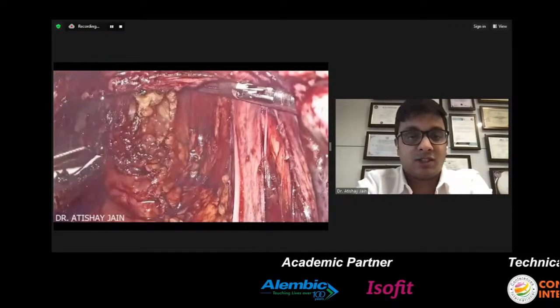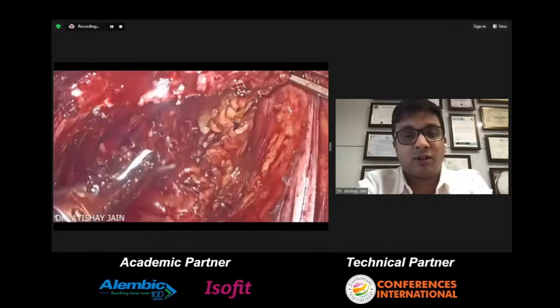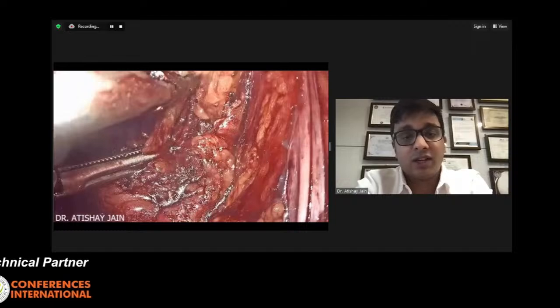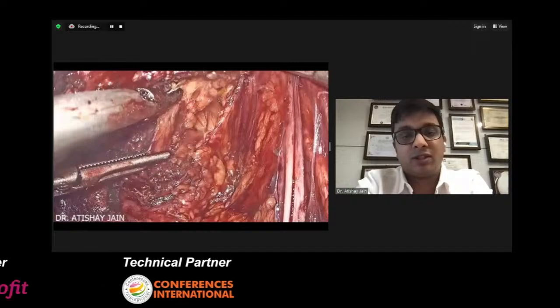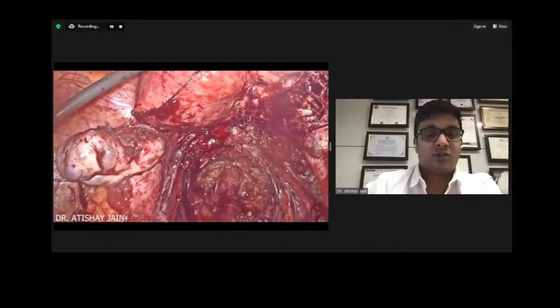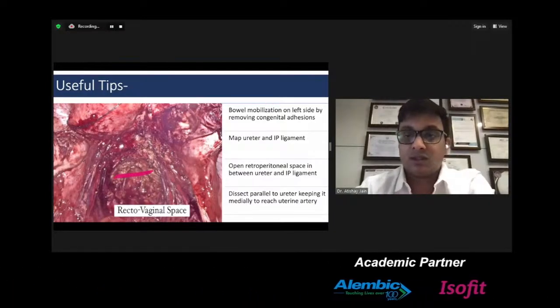So as you can see now, the rectovaginal space is being created, which is usually obliterated due to the involvement of the rectovaginal nodule. And the rectovaginal nodule you can either cut it towards the vagina or towards the rectum, and then shave the rectum if it is superficial, or plan another management for it depending on the depth.